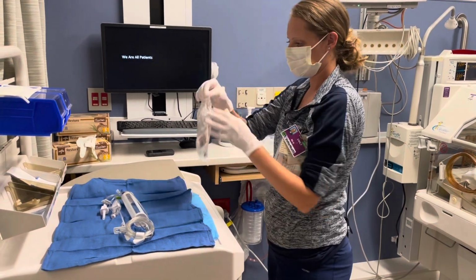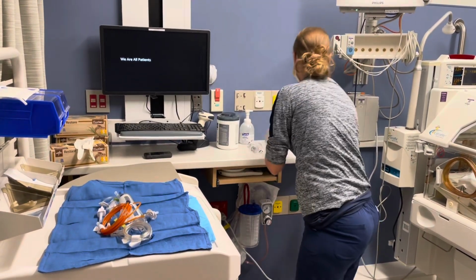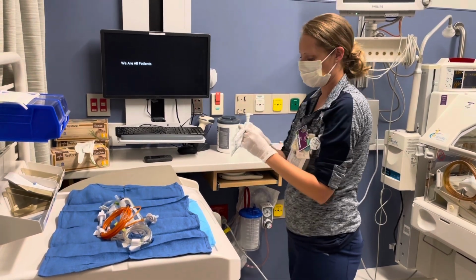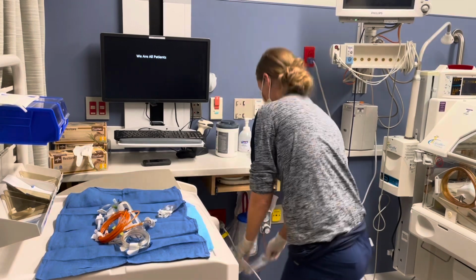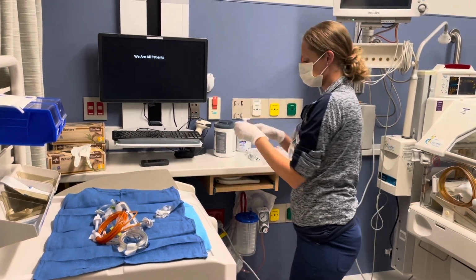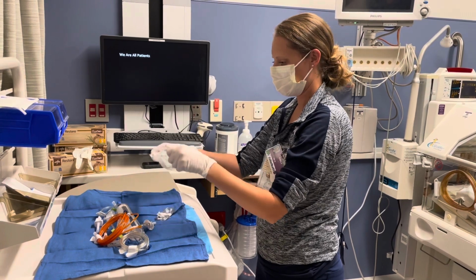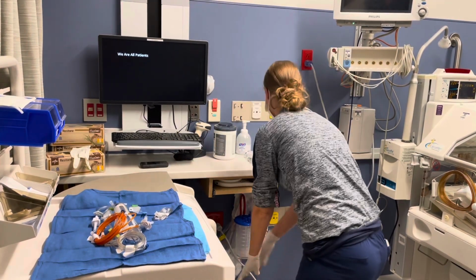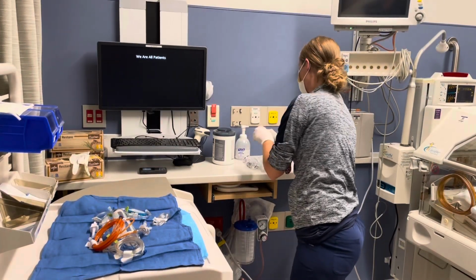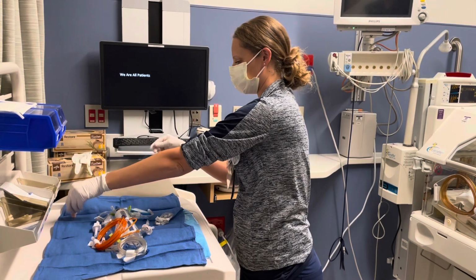In the NICU, we use the IV tubing with the Buretrol. The Buretrol creates another safety feature to minimize excess fluid getting to the patient in the event of an IV pump malfunction. Emily is laying out her IV tubing with a burette, a 3-way extension tubing, Medline tubing, microclaves, and has her swab caps to the side.